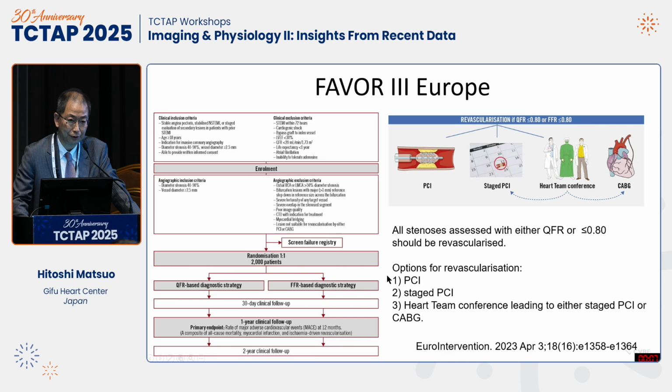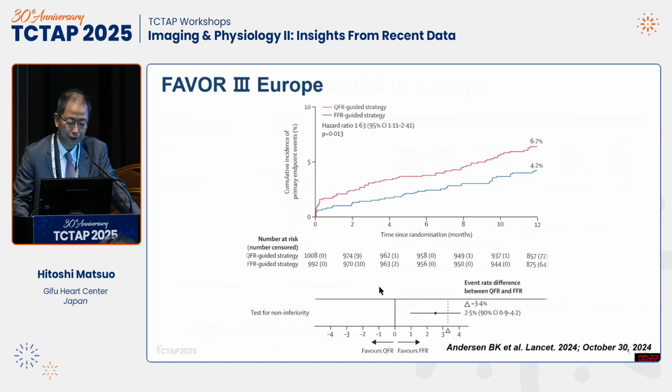Also, the FAVOR 3 Europe trial is a prospective randomized trial comparing a QFR-based diagnostic strategy versus an FFR-guided diagnostic strategy. We couldn't demonstrate non-inferiority compared with FFR.